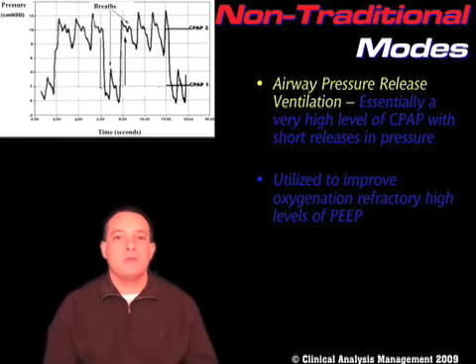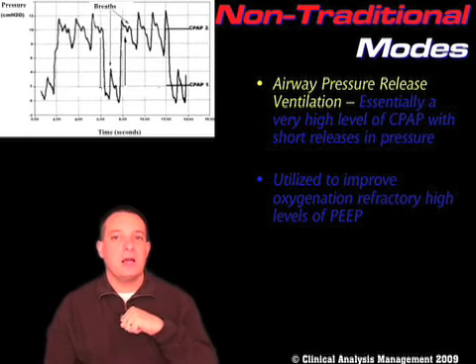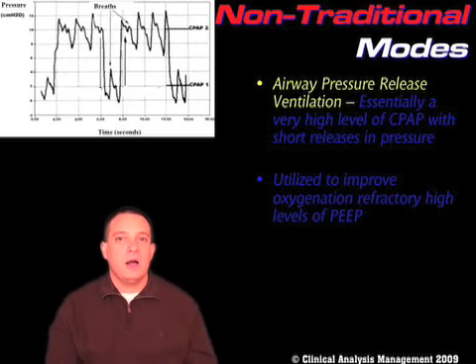So we use airway pressure release ventilation typically for patients who have severe ARDS, severe hypoxic respiratory failure that's refractory to other things like I said before, like adding just regular PEEP or just adding inspiratory time or adding oxygen or those types of things.